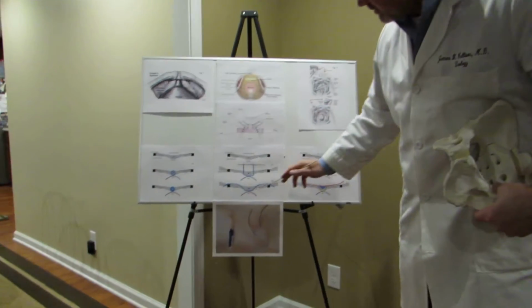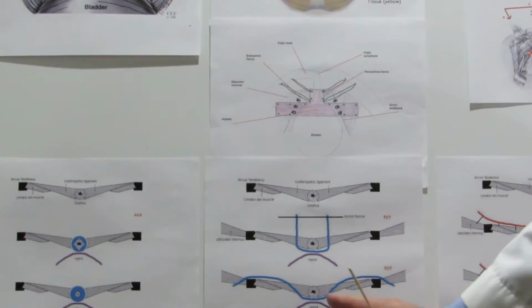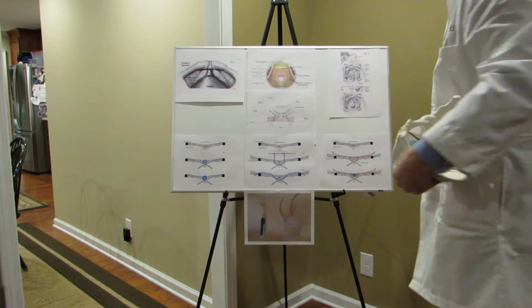Basically, this is another one. It's called a transobturator sling, and this was done through the vagina as well. You cut through here and you run the sling this way, and you pull it. So these are slings, suburethral. They go under the urethra and pull up with certain forces.